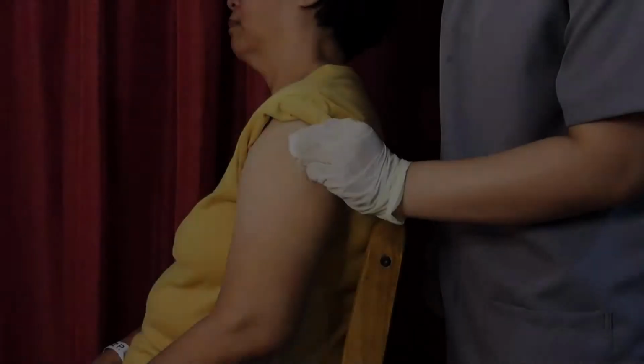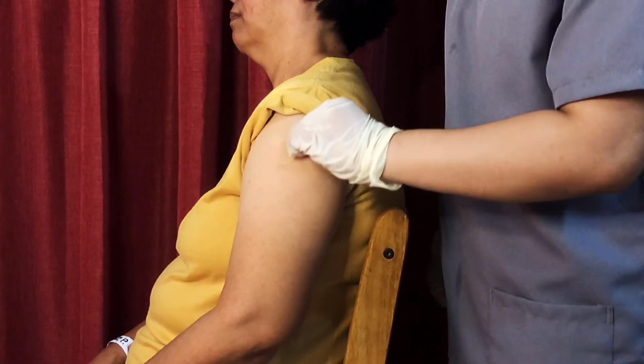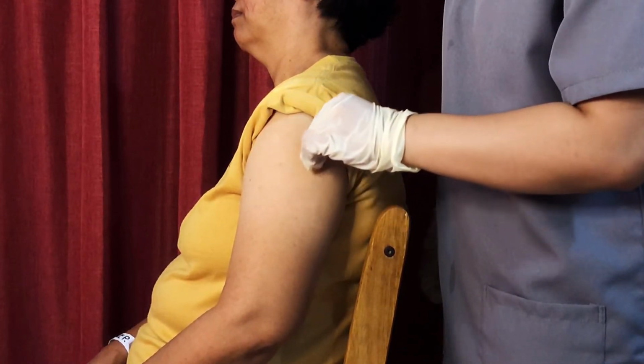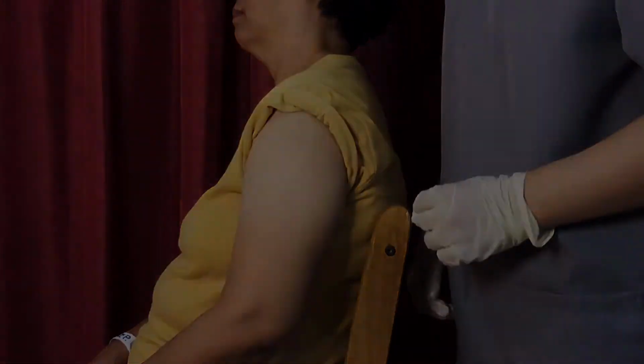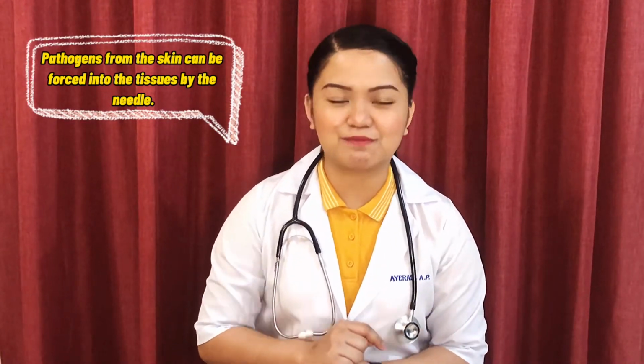Choosing the correct site allows for accurate administration. And then, clean the site with an alcohol swab or antiseptic swab. Use a firm circular motion and allow the site to dry. Pathogens from the skin can be forced into the tissues by the needle. Allowing the skin to dry prevents introducing alcohol into the tissue, which can be irritating and uncomfortable.